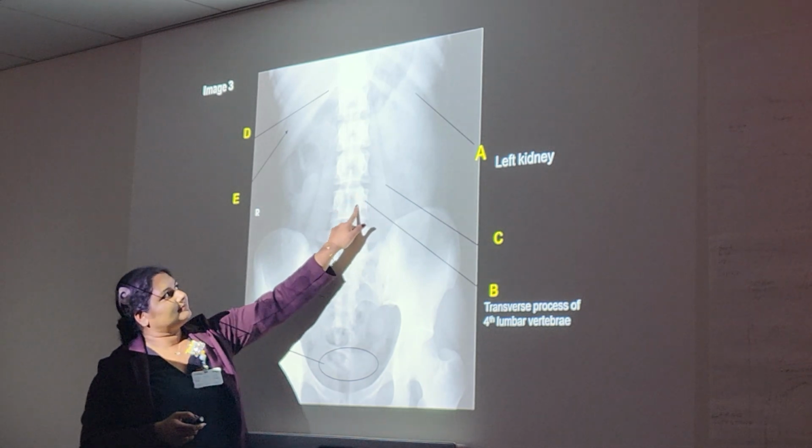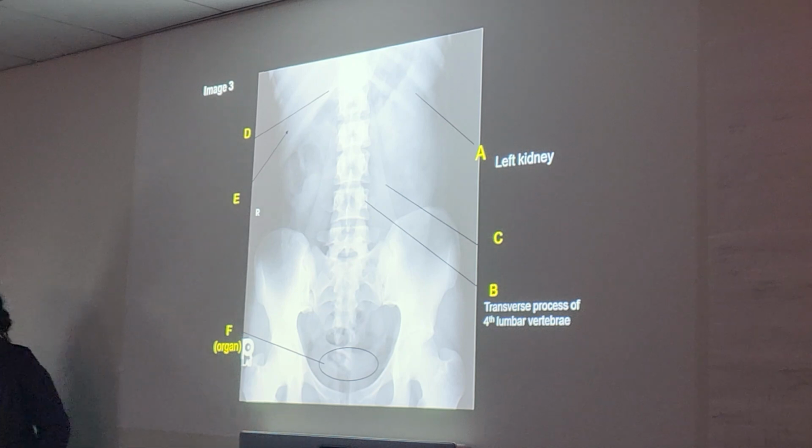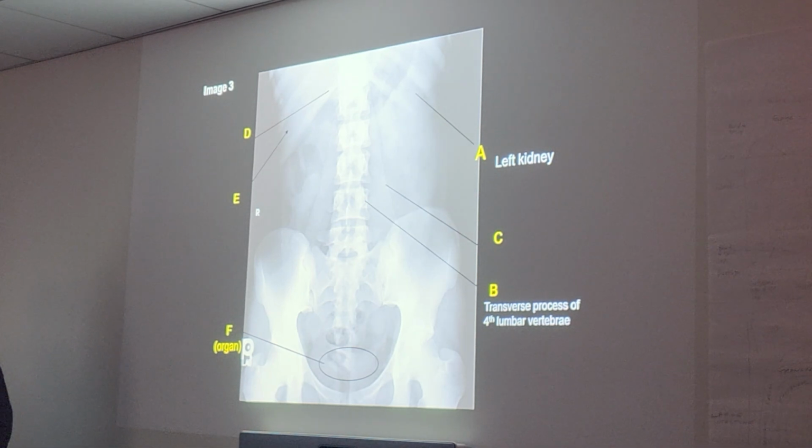You have to bring that line out. The whole thing. You've got to get some better images than that. Well, don't put pedicle on the test then, and then we'll know this class is a hard crowd. So here, we won't have any choices. Miss Bonilla, I'll give you choices. I'll give you choices. Yes.